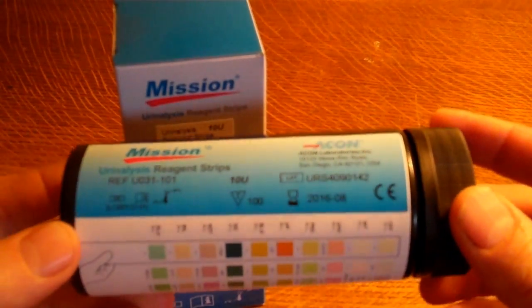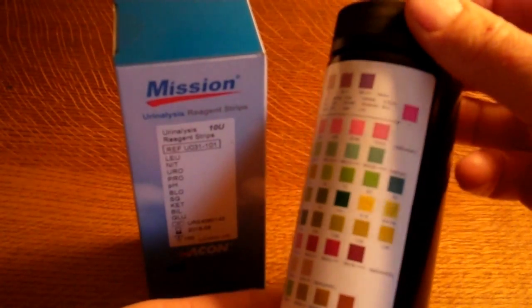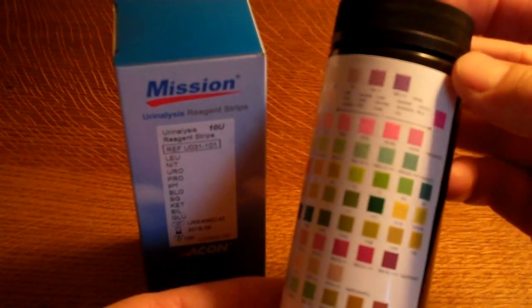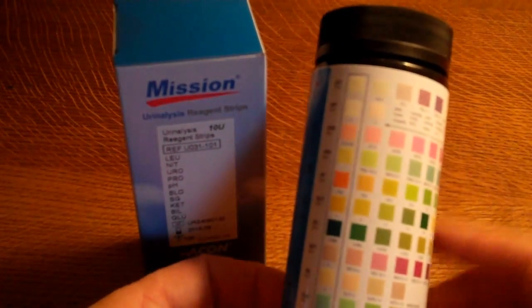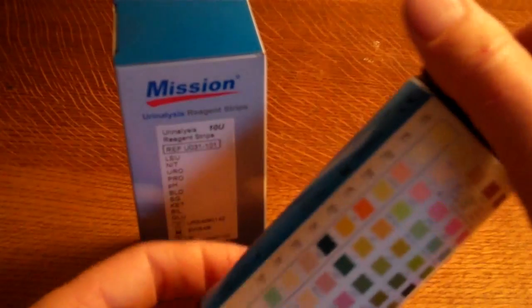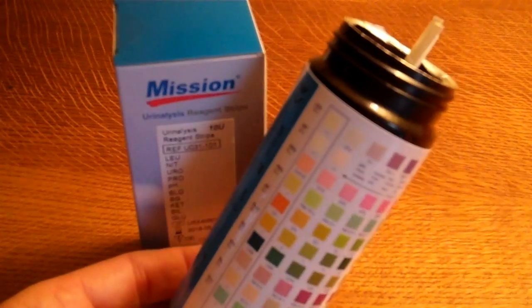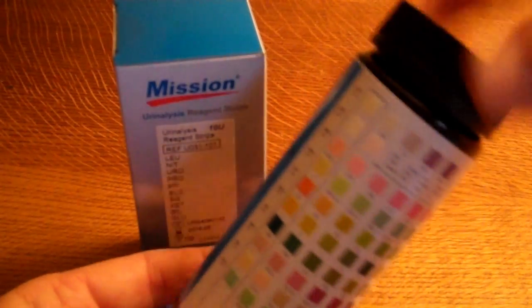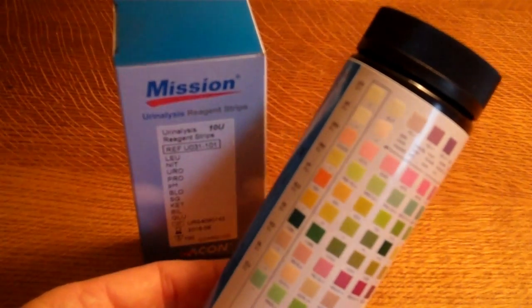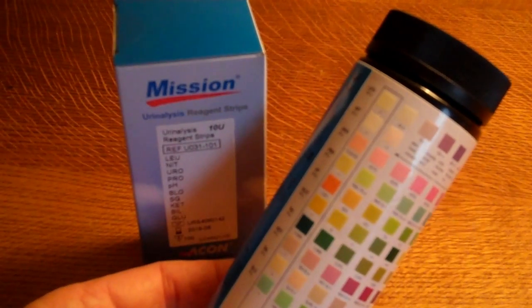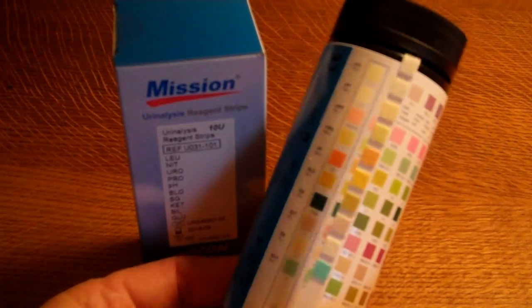On the pack attachment you've got these 10 parameters, and if we remove one of the test strips from the vial you will see that on the test strip you have a matching 10 parameters.